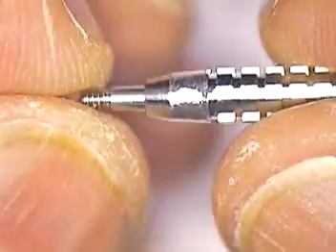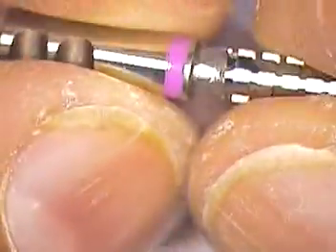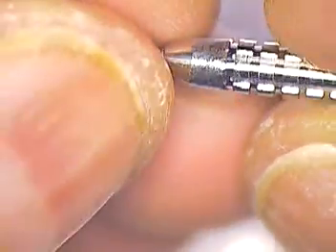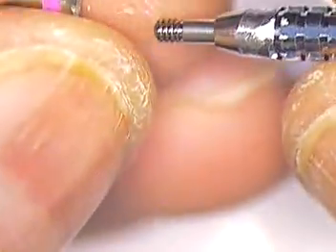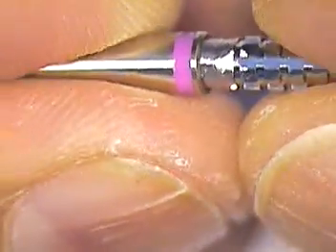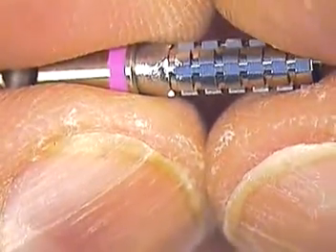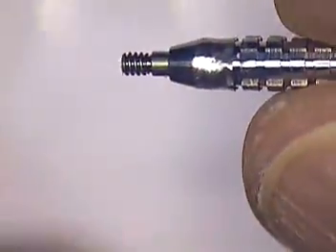Straumann really needs to study their format better. Other companies, you can do the same thing — take the analog in your hand and if you have to work it out, fine. Now, this is for a bridge. If it were for a single crown and you're going to make a temporary, there would be some anti-rotational seating in here, but it still seats pretty well. By the time you place your basal screw in there, it should line up nicely. I hope this helps both dentists and laboratory technicians with their cases.